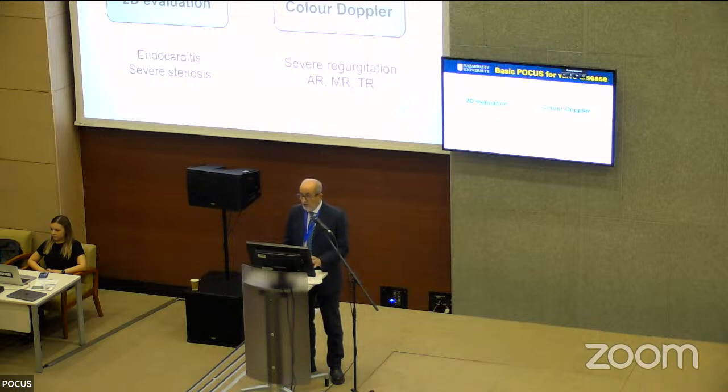Two-dimensional evaluation for endocarditis and for severe stenosis. Color Doppler for severe regurgitation, aortic, mitral, tricuspid regurgitation with the goal of finding the severe regurgitation. What is not severe, it's out of our interest. We want to look and diagnose the severe valve disease.